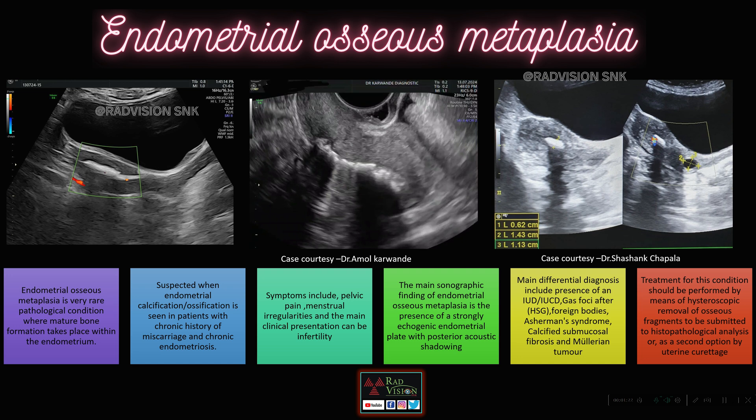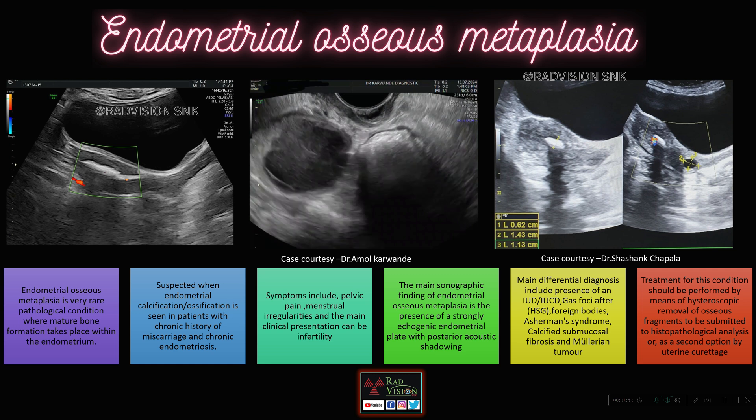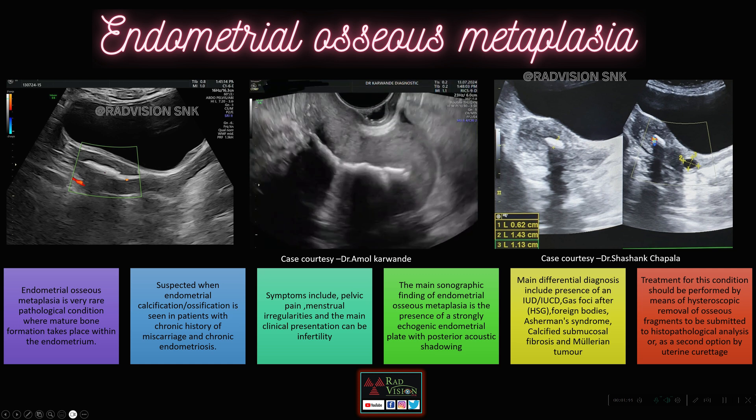Sonographic findings include echogenic endometrial plate with calcifications or ossifications and post-acoustic shadowing. Differentials to consider are intrauterine contraceptive device, gas mimicking this pattern after HSG, foreign bodies, Asherman syndrome, calcific submucosal fibrosis, and Müllerian tumors. Treatment will be hysteroscopic removal of osseous fragments with histopathological correlation, or uterine curettage. This was a classical case of endometrial osseous metaplasia.